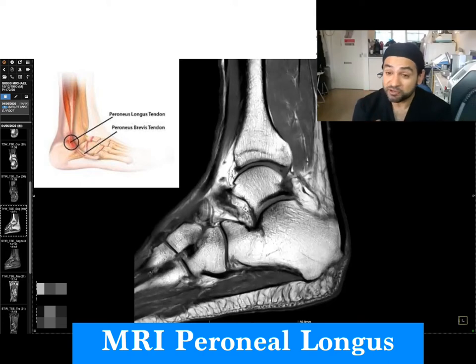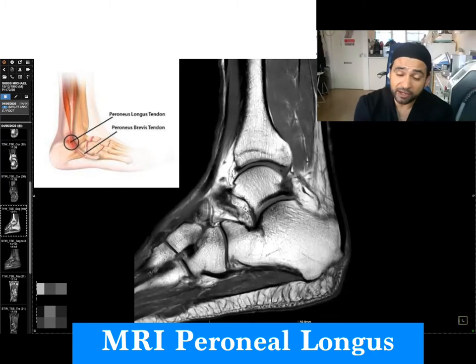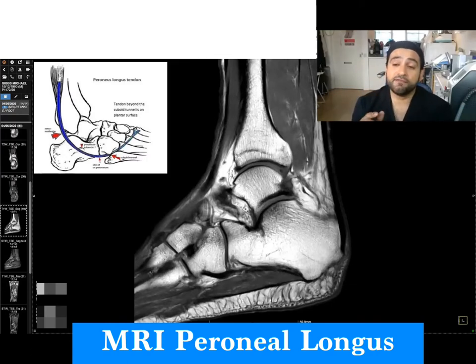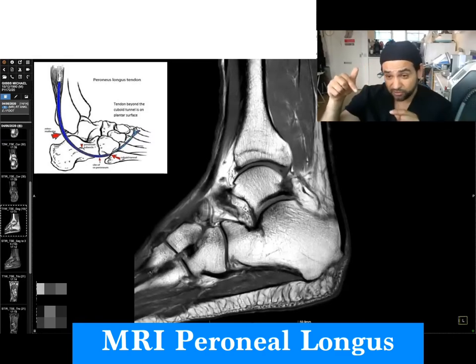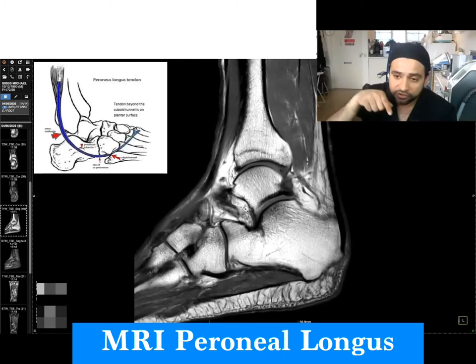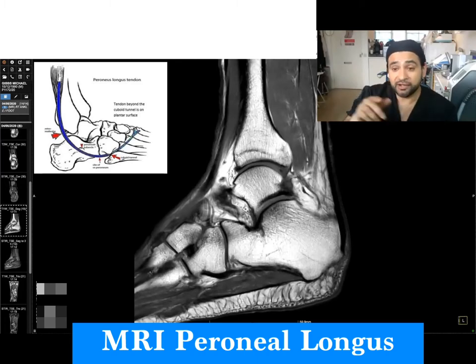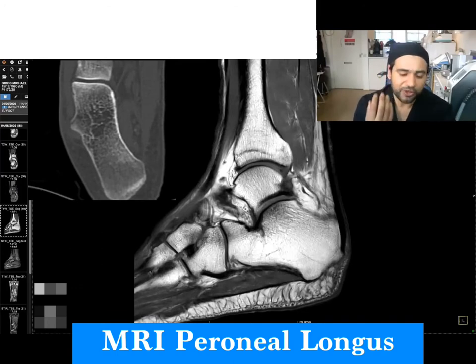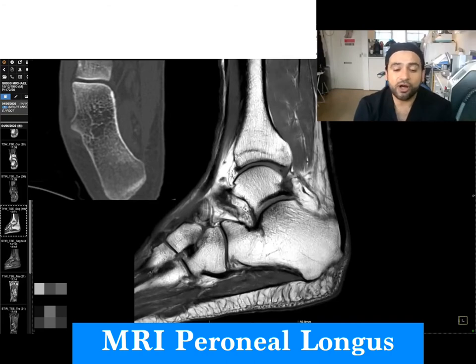He has peroneal tendinopathy. The peroneal muscle and tendon come around the ankle, and patients often get pain on the outside of the ankle. This particular patient is getting pain from his peroneal tubercle, just before the actual muscle tendon goes under the cuboid and across the foot. He's actually got an enlarged peroneal tubercle, which may be one of the reasons why he's got this.